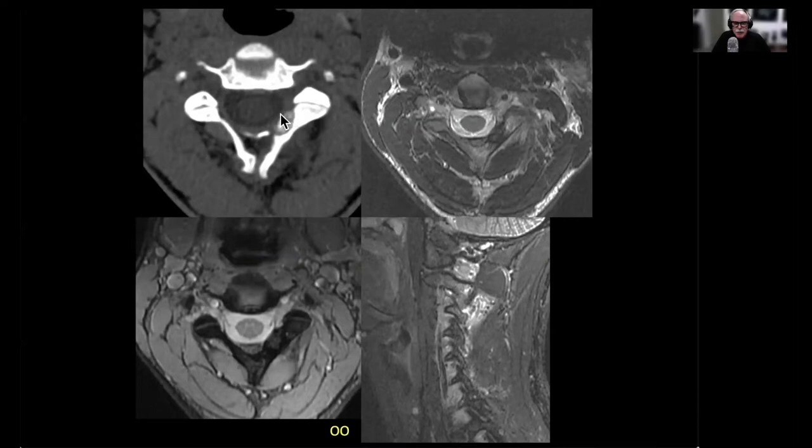Here's a CT showing the pretty classic pattern of the nidus — well-defined, with a bony calcific matrix. And then on the MR, a little bit more nonspecific low signal. You can see some of the edema in the adjacent soft tissues and the marrow from that lesion.